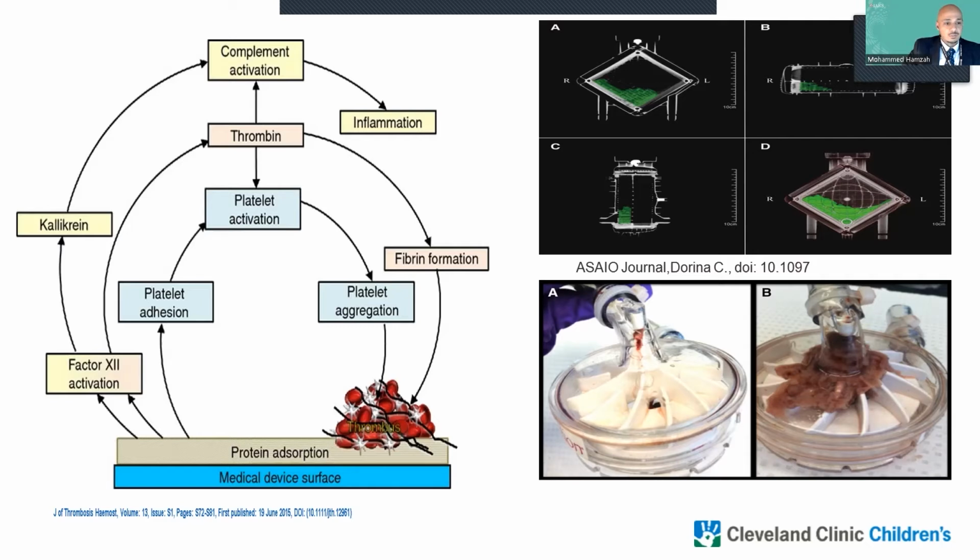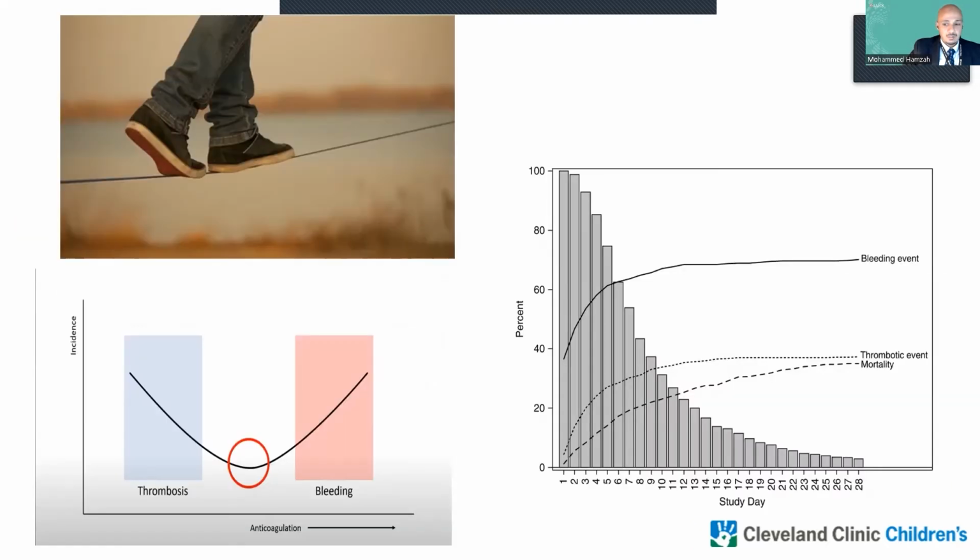And what's important also in that, using this technology, they were able to detect thrombus burden in all ECMO circuits that were in that study. So despite optimal anticoagulation, there was thrombus formation that's already in fibrin depositions. So with the current technology in ECMO, systemic anticoagulation is needed to prevent circuit thrombosis.